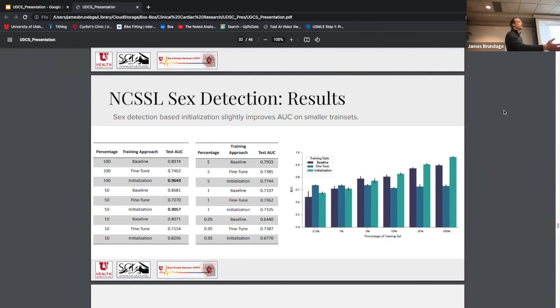I didn't spend a ton of time on it. So it may be that with more work, because a regression problem would be better, right? If we could just say, hey, this is the actual percentage, that's clinically way more useful. Regression tends to be a bit harder. Yeah, right. With the binary label you can do on the continuous state, it's harder to optimize. So I think that's a really interesting problem.